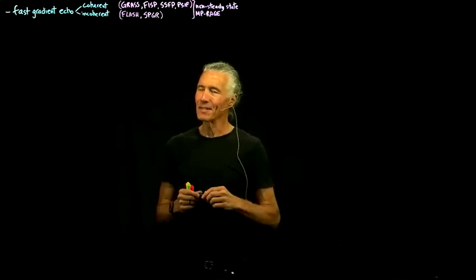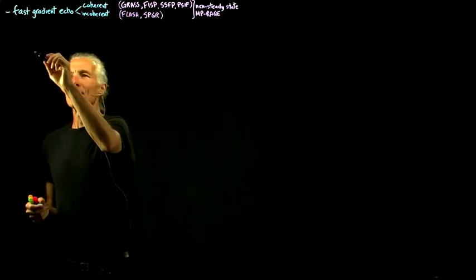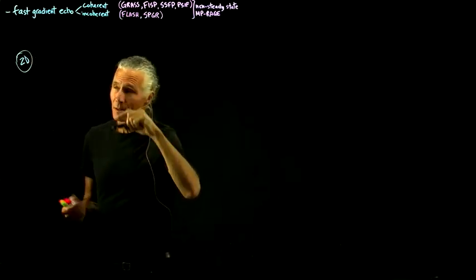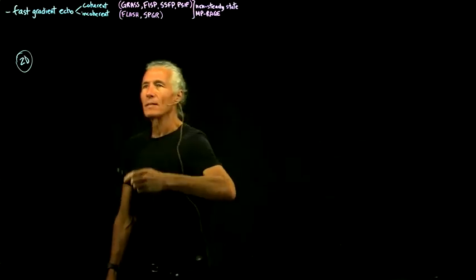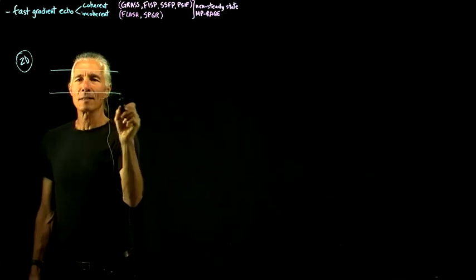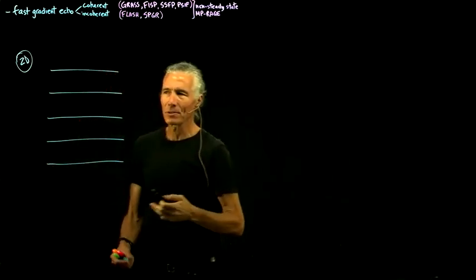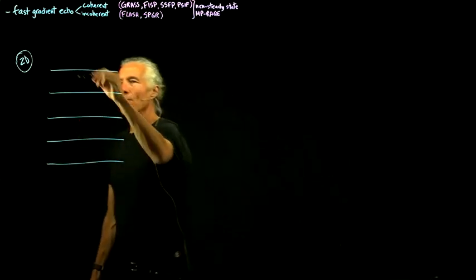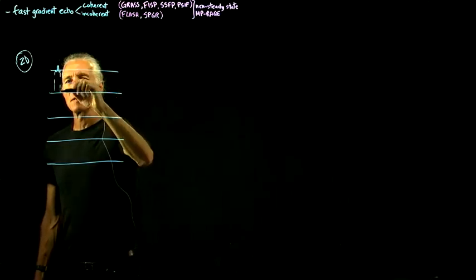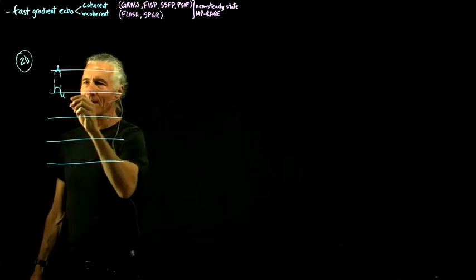So even before the coherent ones is slow gradient echo, because remember we talked about slow spin echo. Back in the day, they started off with slow gradient echo. This is a 2D sequence. You can do it in 3D also, but I'll just draw out a 2D one. Slow gradient echo is basically just one pulse and record some data. So we do one pulse, say a 90, and then we pick out a slice and fix the effect of having picked out the slice.